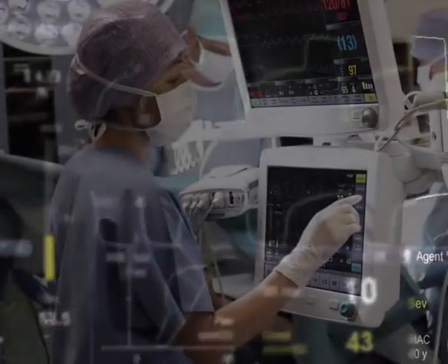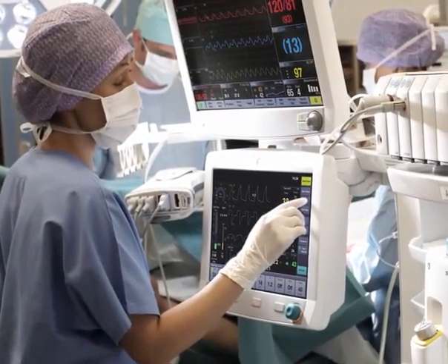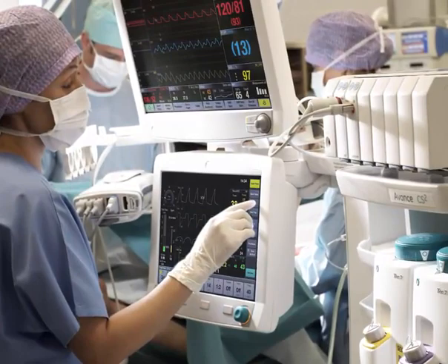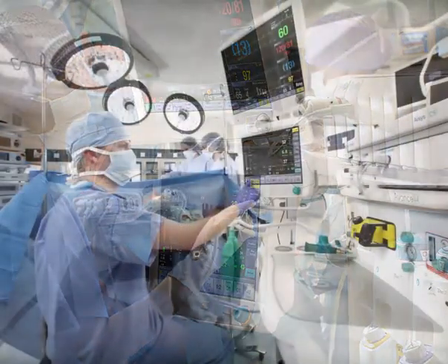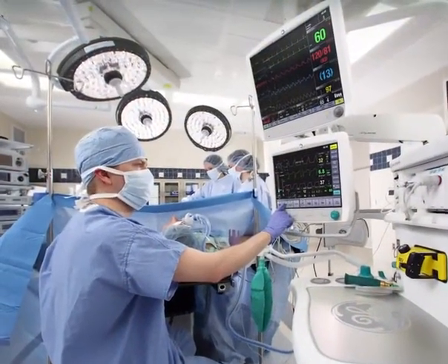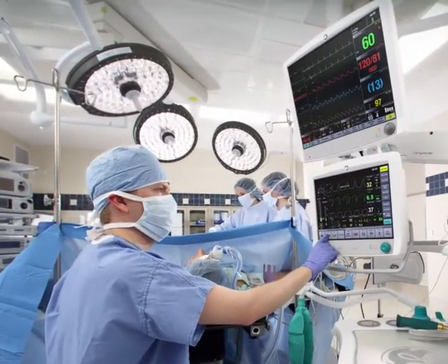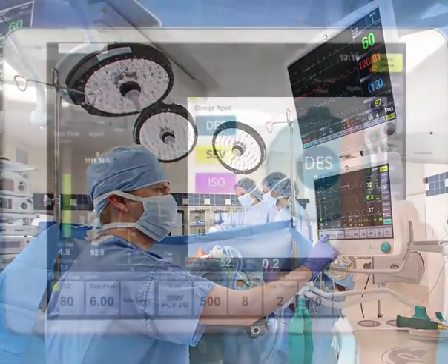GE's anesthesia care stations, supported with ECOFLOW technology and GE's innovative gas monitoring technology, help clinicians achieve the cost benefits of low-flow anesthesia without compromising patient care.